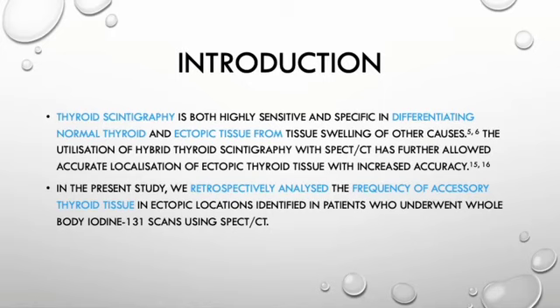This is compared to using other forms of cross-sectional imaging or ultrasound and deciding whether or not that tissue is thyroid tissue. In our study, we retrospectively analyzed the frequency of accessory thyroid tissue in ectopic locations identified in patients who underwent whole-body iodine-131 scans using SPECT CT.